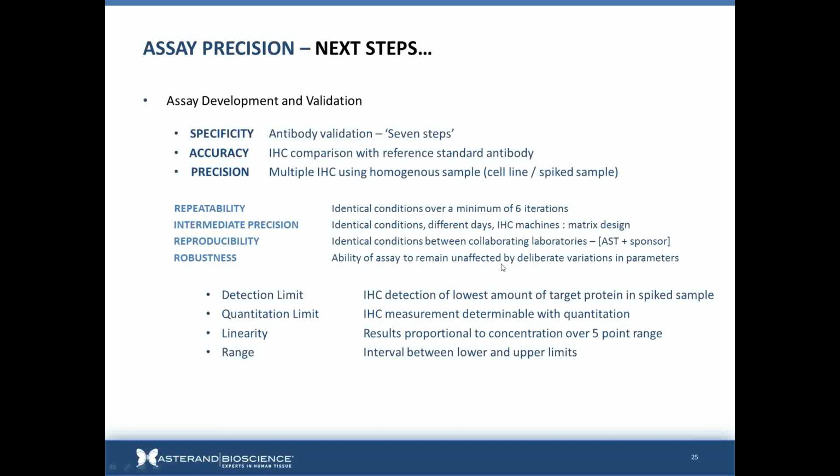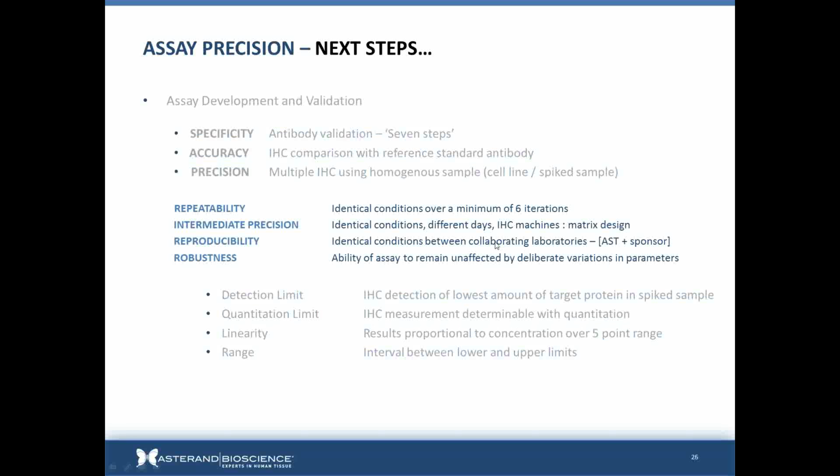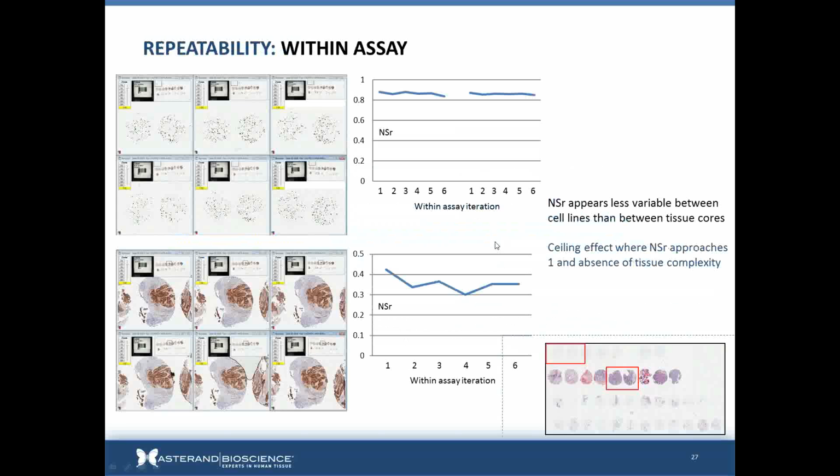So how does D1C2 perform across the remaining assays required for thorough validation? We have a few more to look at here. The first one we're going to look at is assay repeatability. What this assay does is it looks at the consistency between slides within a particular assay. All of our DACO autostainers are IQ, OQ, PQ validated, which measures the same endpoint, so we're not expecting too many surprises here, I don't think.